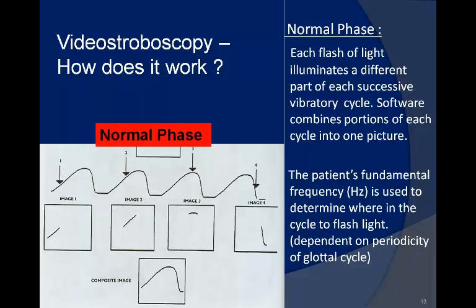Thus we are not seeing true real-time slow motion vocal fold vibration. We are seeing what we call apparent vocal fold vibration. Still, this is very useful and it's a good method of laryngeal examination.